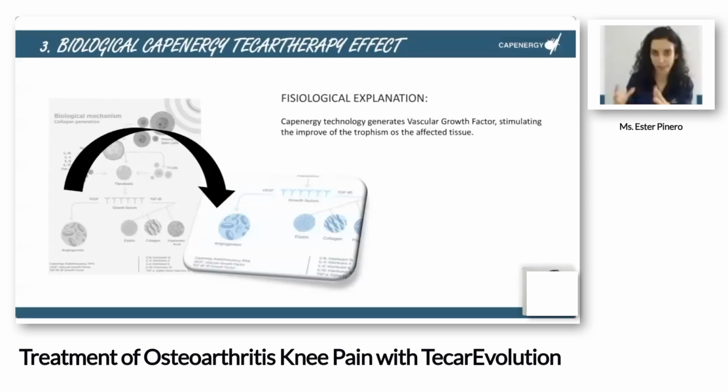Then we increase the blood in all the tissues that we are feeding, and it's a good thing to have a good arrival of blood to the area, okay, to bring more oxygen, more nutrients to this area, and also because we want to have a good trophism of the muscles that are around this knee, okay, all quadriceps, all hamstrings, that we need to have all these muscles with good trophism to have a good contraction and to make the strength of the patient grow.